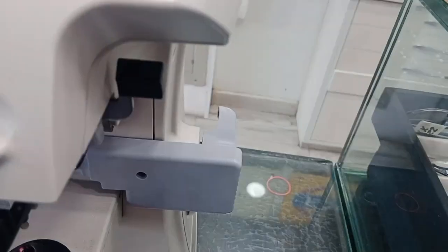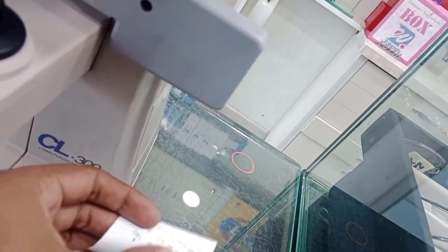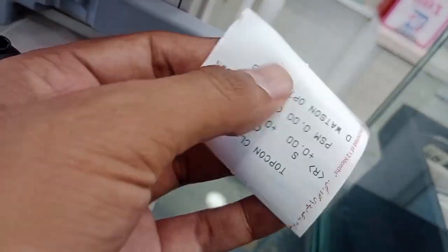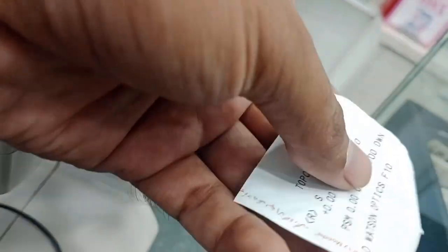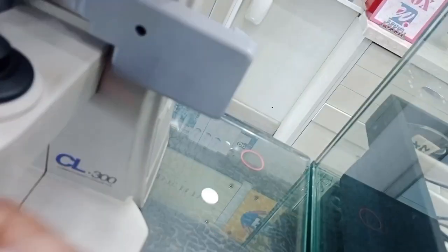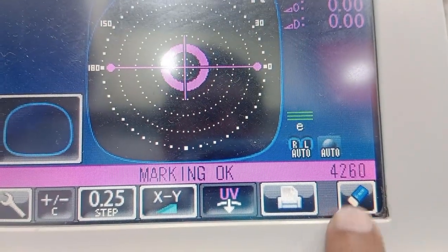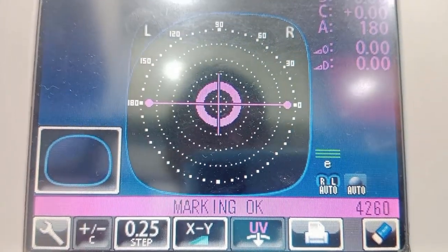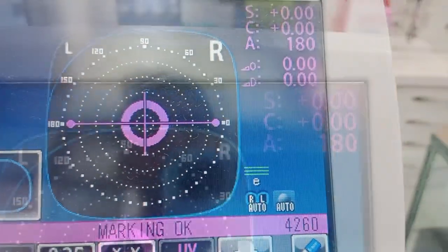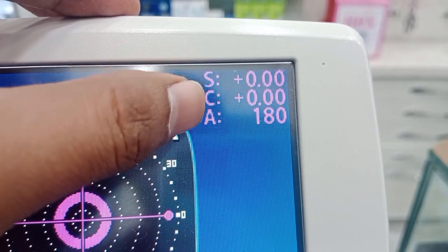There is a print button — pressing it gives you a printout. Since there is no lens, all values are at zero. The next button is the clear button, which clears all the settings. The display shows spherical, cylinder, and axis values.